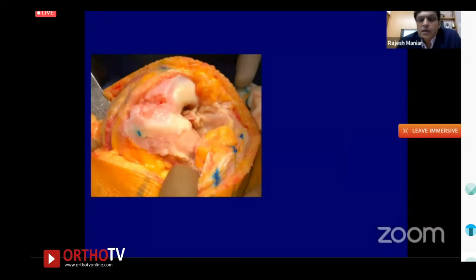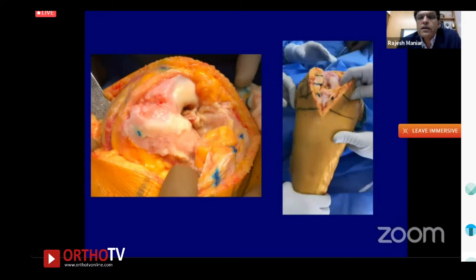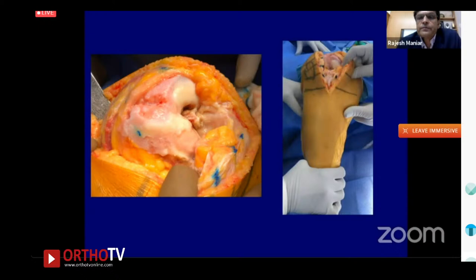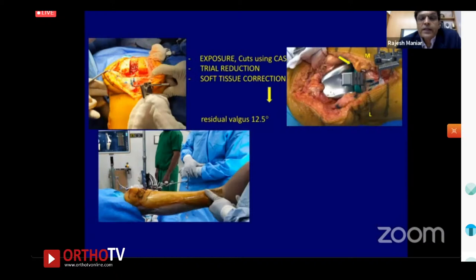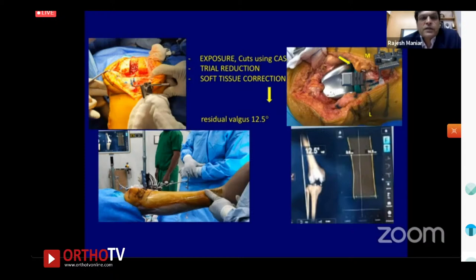On exposure of this osteoporotic valgus knee, the VMO is right in front, the patella is completely lateral. You can see where the patella was articulating — on a flat lateral surface. After standard cuts, trial reduction, and soft tissue corrections, the knee was still at 12.5 degrees of valgus, requiring further correction.